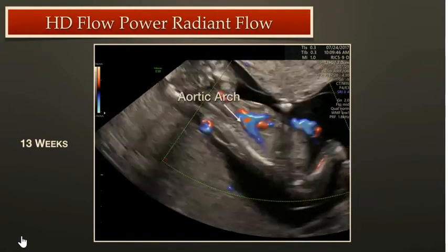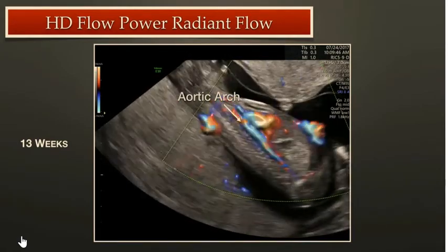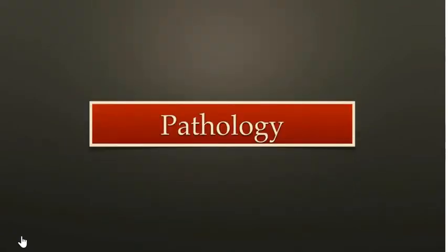Notice how clearly the aortic arch is displayed. Let's examine several cases of pathology that elucidate the imaging principles previously described.